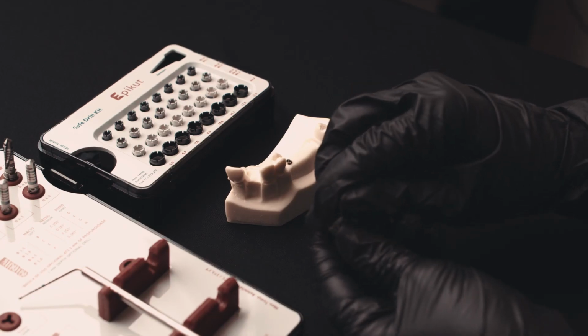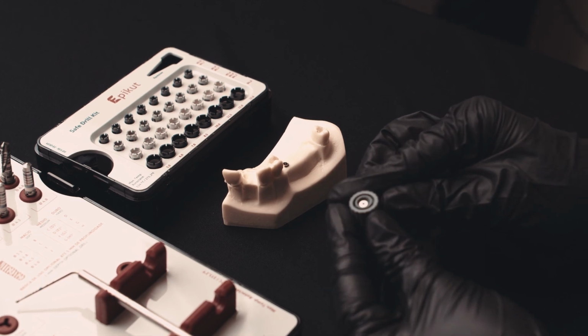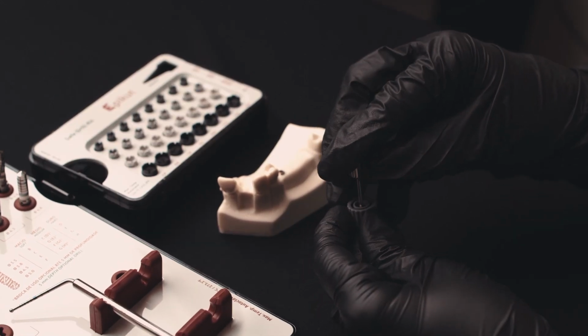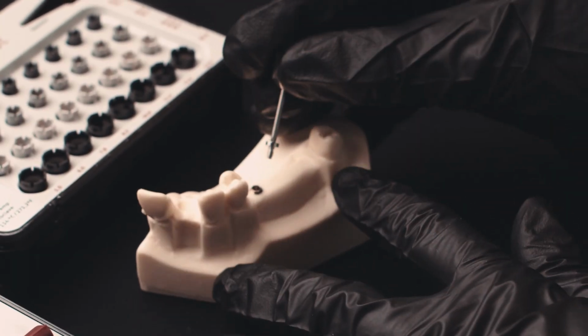Remove the cover screw from the cap of the blister. With the 1.2 mm hexagonal driver, attach the cover screw and install it.